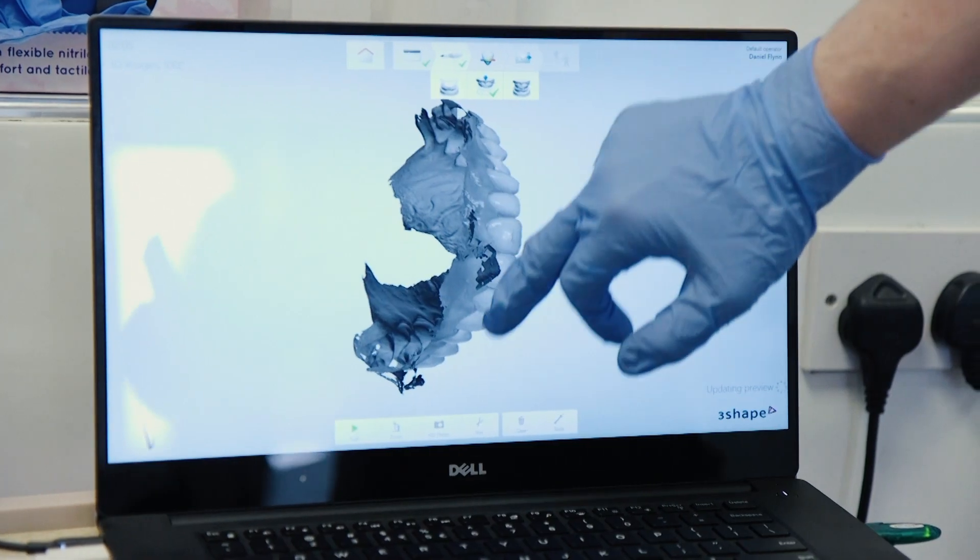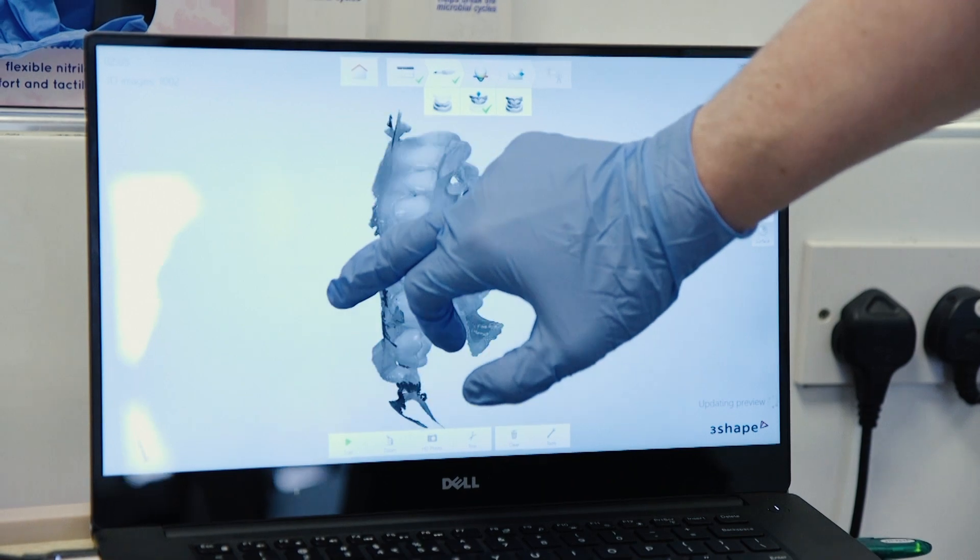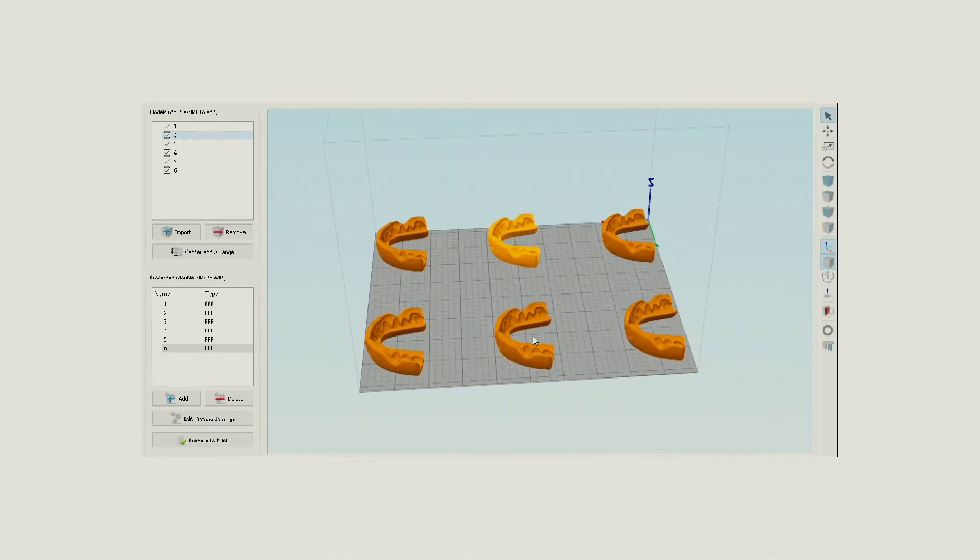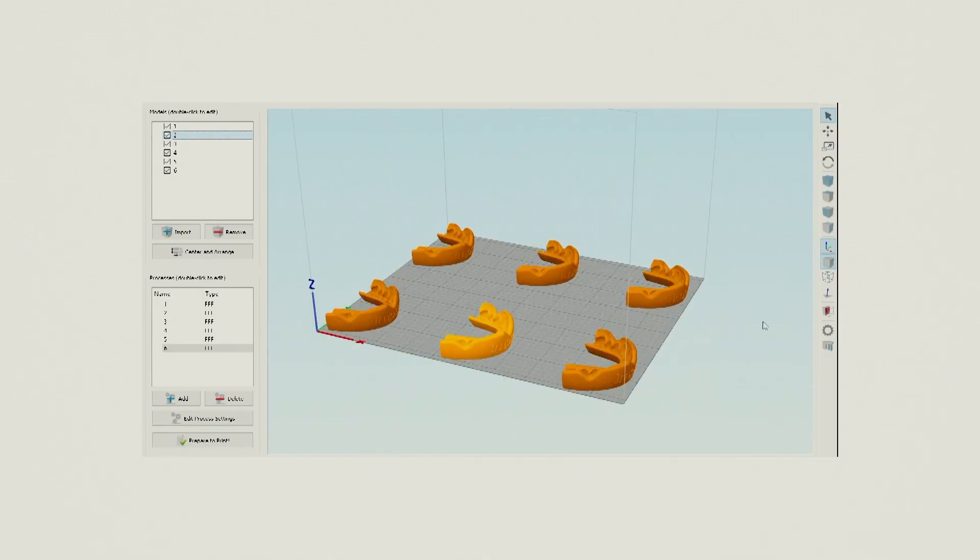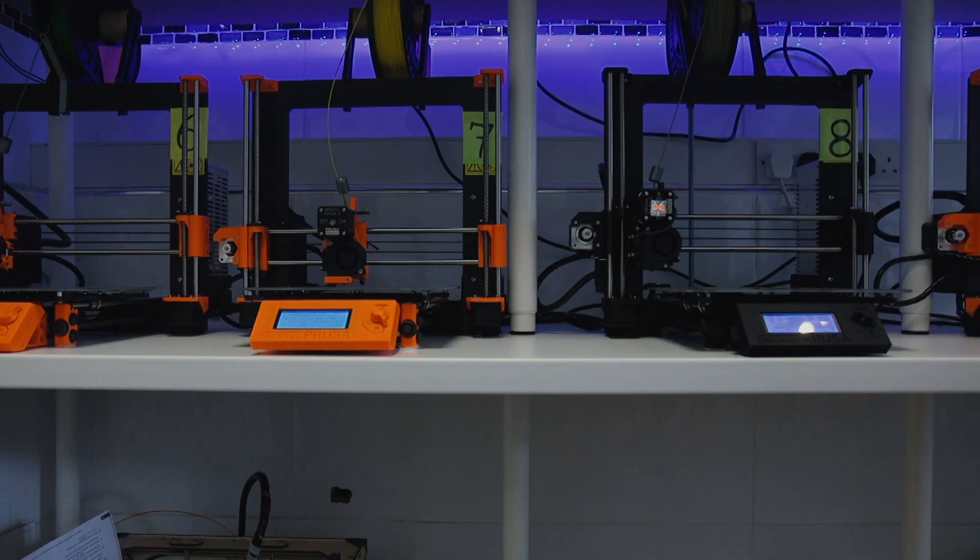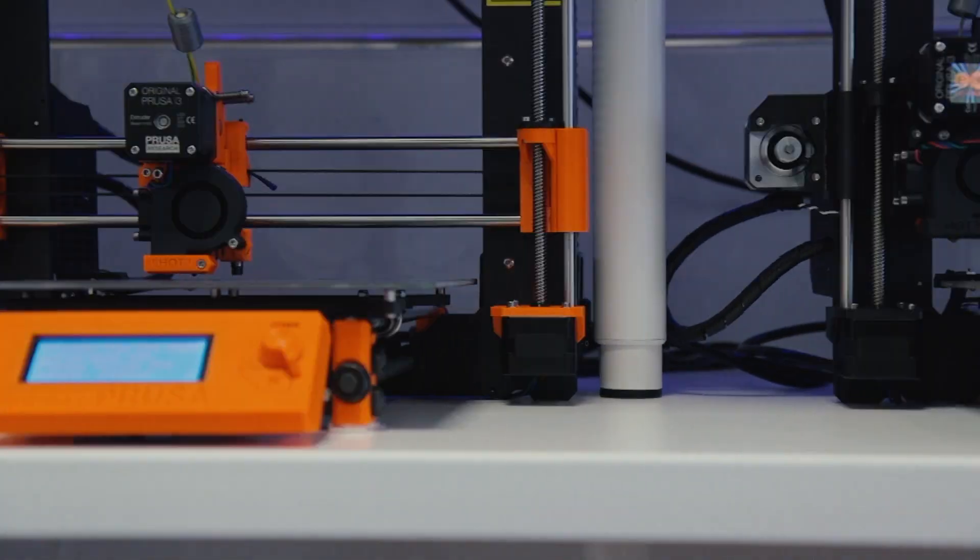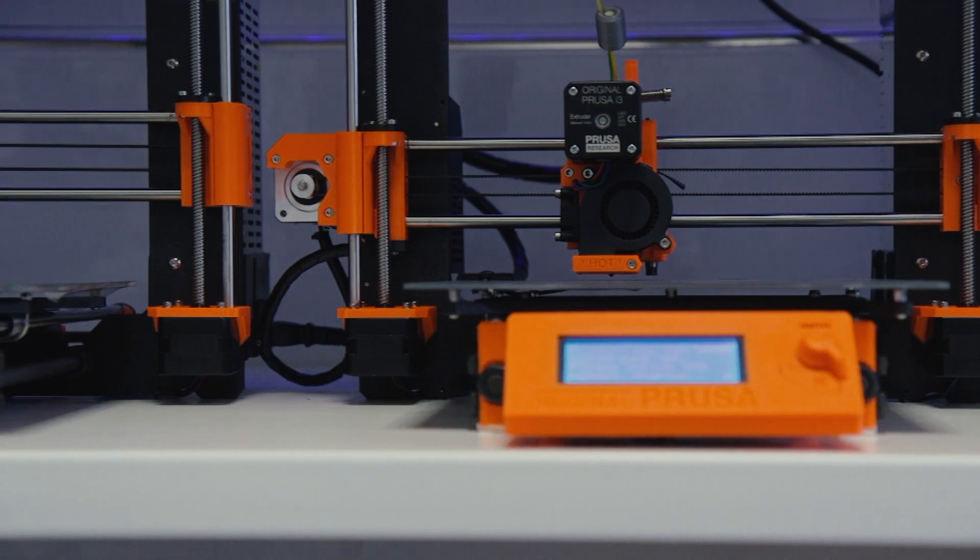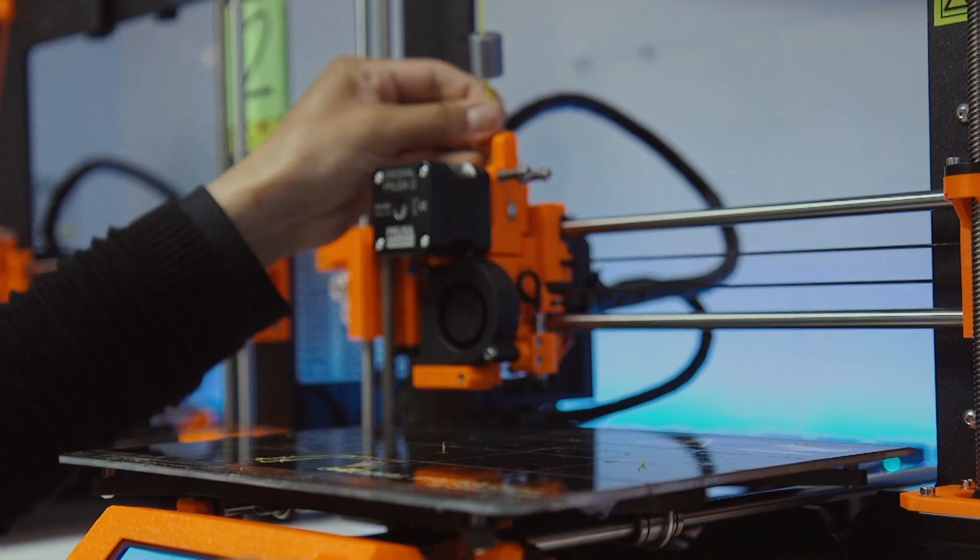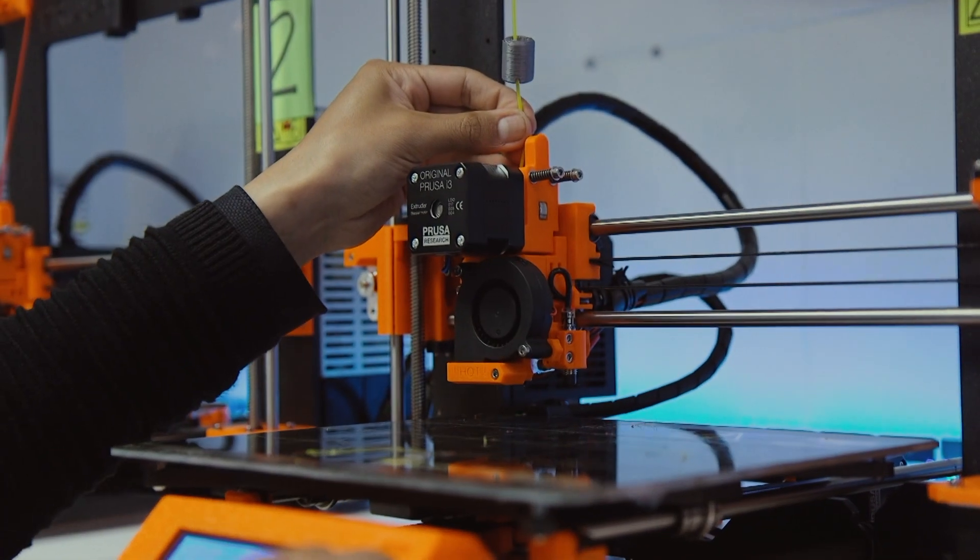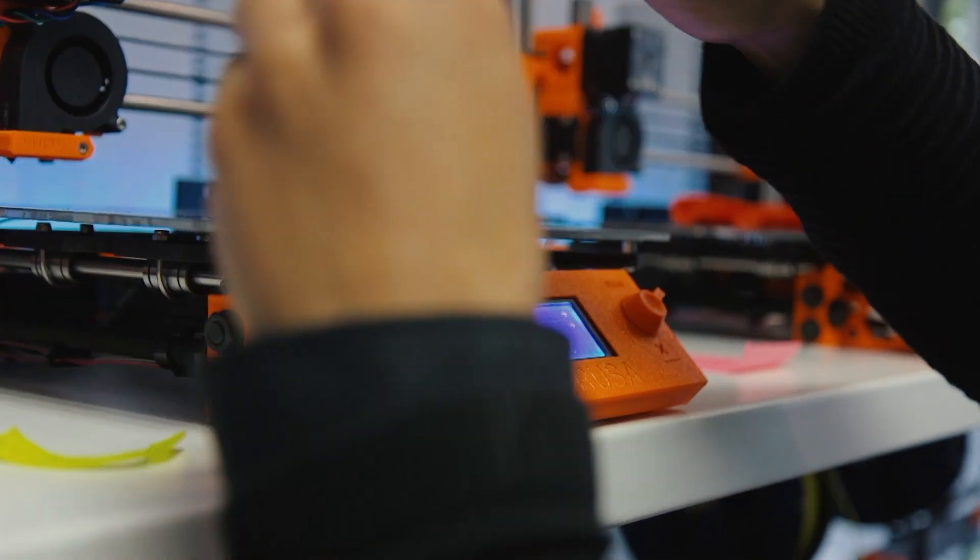Once we have that gum shield file, we'll then send it to one of our 12 printers that can print it within 45 minutes. So the process itself is incredibly quick.